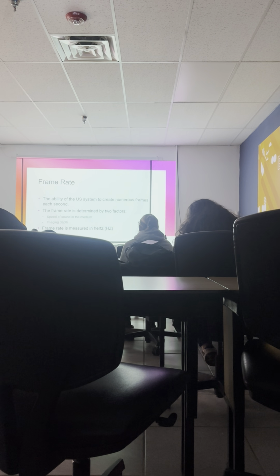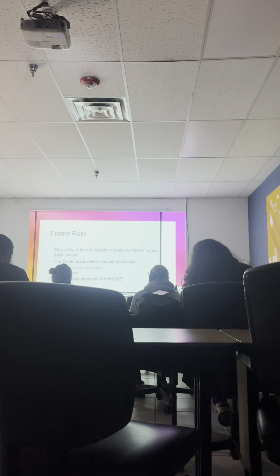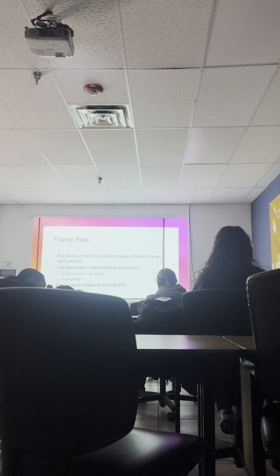Which is exactly right, because how does a machine know when to send out a pulse? After it receives the echo, right? So the lower the speed of sound in the medium, the lower the frame rate. So speed of sound in the medium and frame rate have what type of relationship? They're directly related. The faster the speed of sound in the medium, the faster the frame rate.